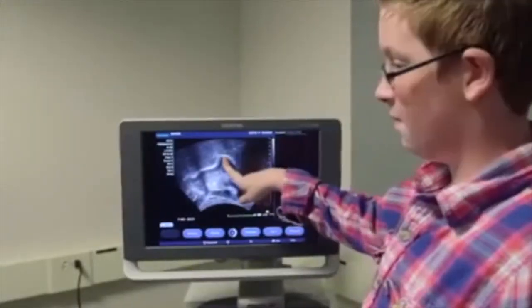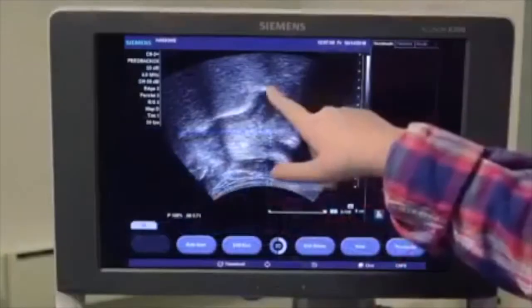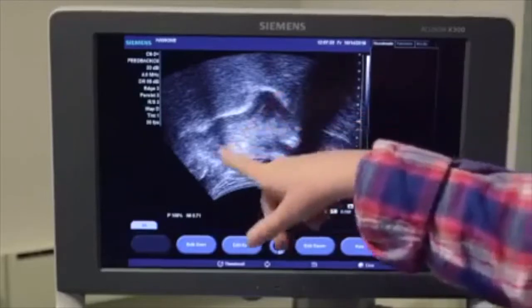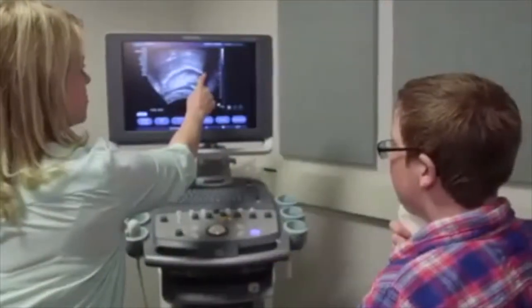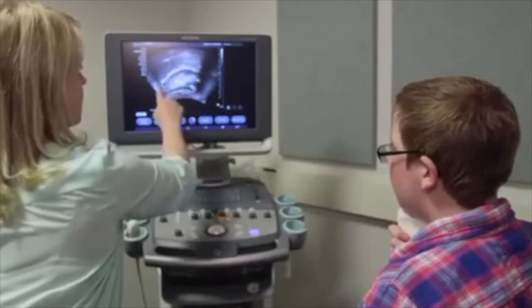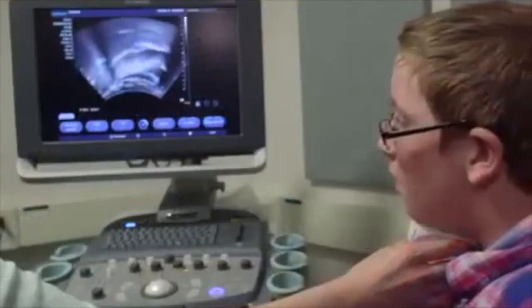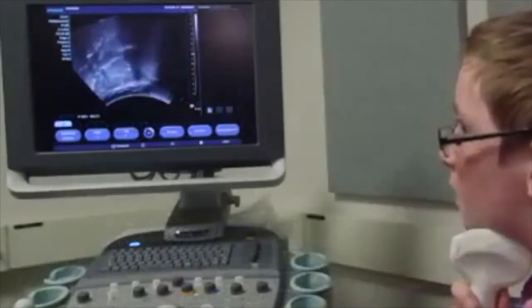Orient the participant to ultrasound images in sagittal section by asking the participant to point to the anterior and posterior regions of the tongue, or front of the tongue and back of the tongue, respectively. Teach the participant about the different parts of the tongue. Show the participant examples of good image quality and bad.